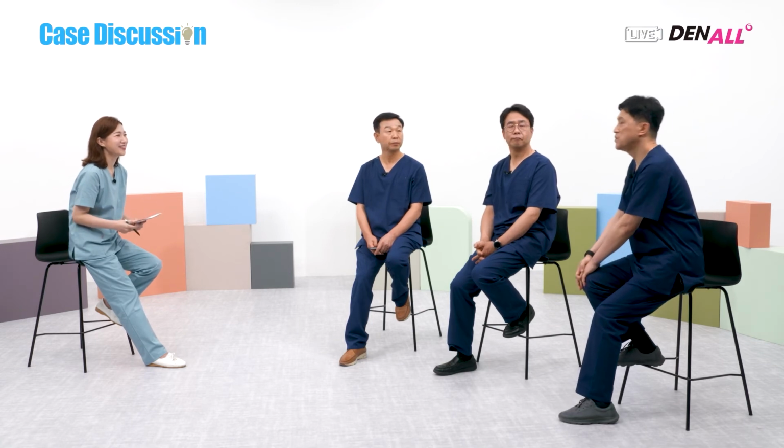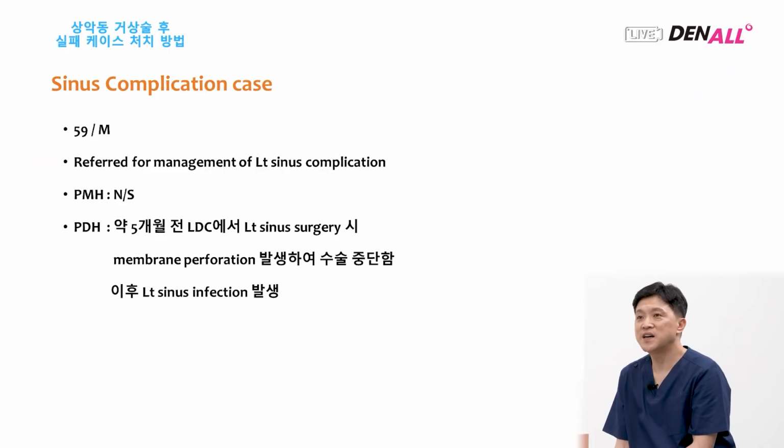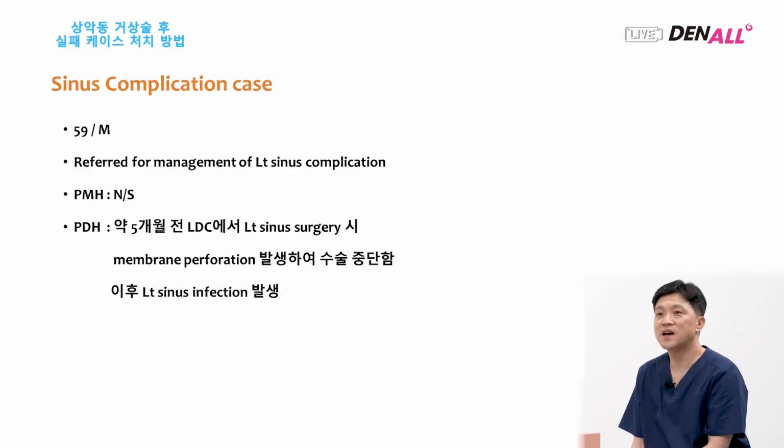Dr. Son? So I have prepared a similar case of my patient, a 59-year-old male. 5 months before, sinus surgery was performed by another dental office, and the membrane perforation occurred, so surgery was stopped, and the patient was referred to me due to the left sinus infection.